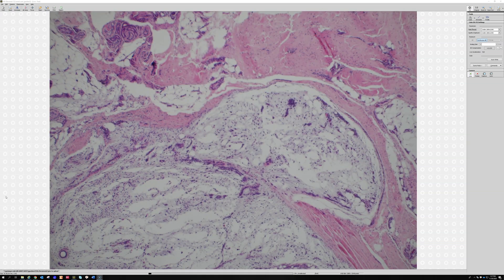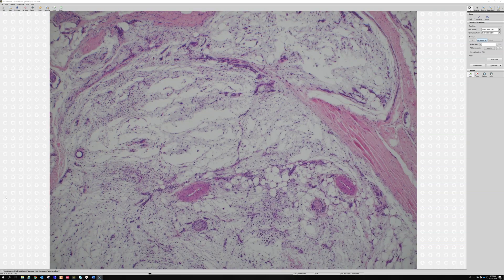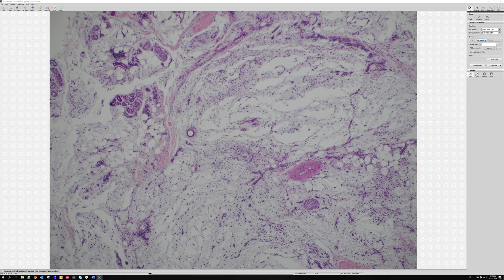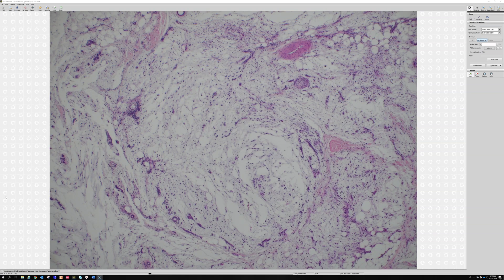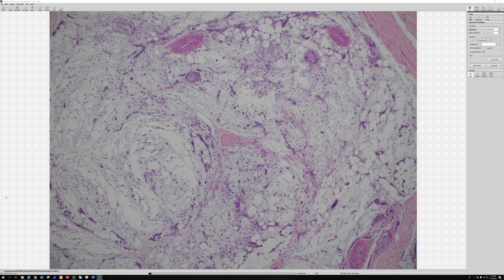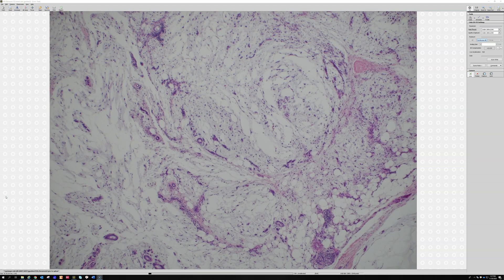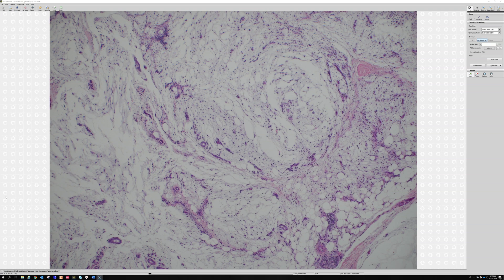If any of you are frustrated by those very confusing names, I'm with you — I understand it's frustrating. I actually have a short video on my YouTube channel that shows how to differentiate myxofibrosarcoma from low-grade fibromyxoid sarcoma pretty easily. But this is a very good example of myxofibrosarcoma, which must have pleomorphism.